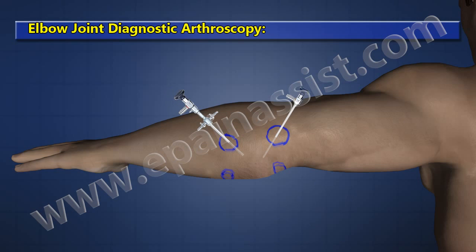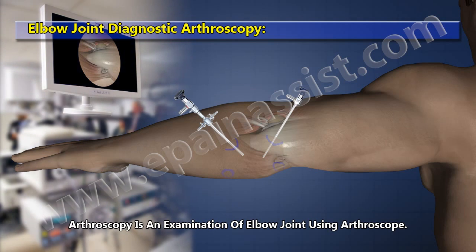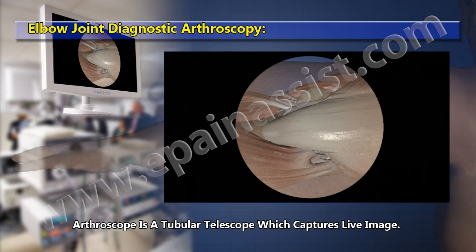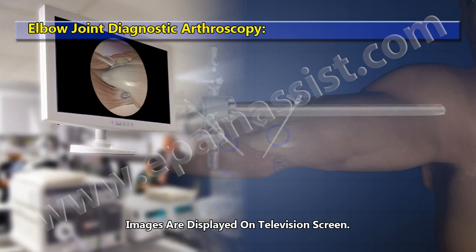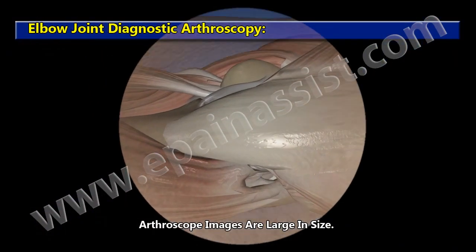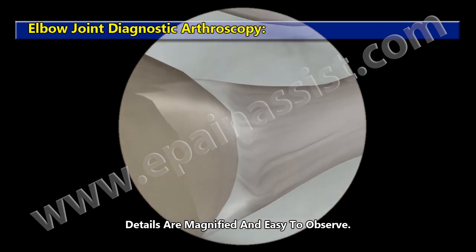Elbow Joint Diagnostic Arthroscopy. Arthroscopy is an examination of the elbow joint using an arthroscope — a pencil-sized tubular telescope that captures a live image. Images are displayed on a television screen, and arthroscope images are large in size, with details magnified and easy to observe.